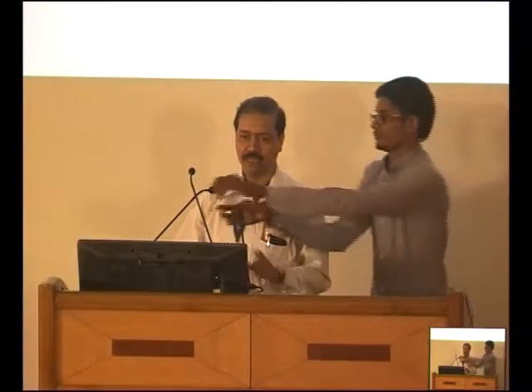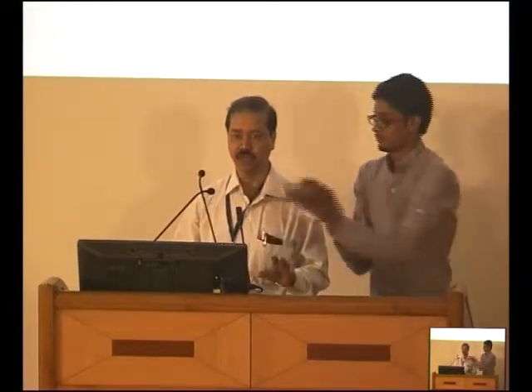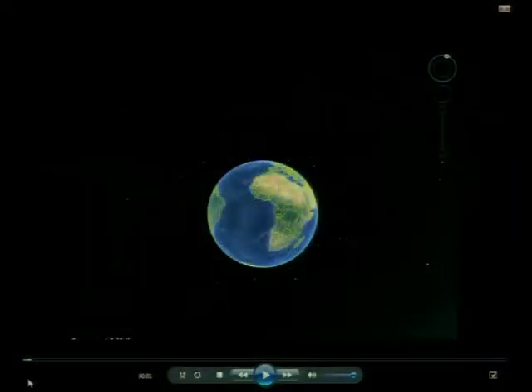So again, this is just a video technique. Arvind told you that we did impedance pHmetry. So you'll have a question in your mind, what is impedance pHmetry? Just before I go to the video, let me explain what is pHmetry. In pHmetry you detect acid. So if there is a reflux which is acidic, that will be detected by pHmetry.